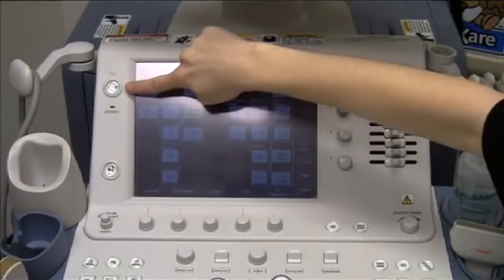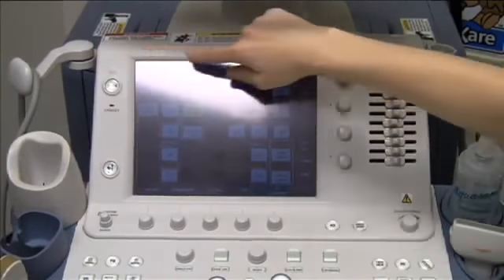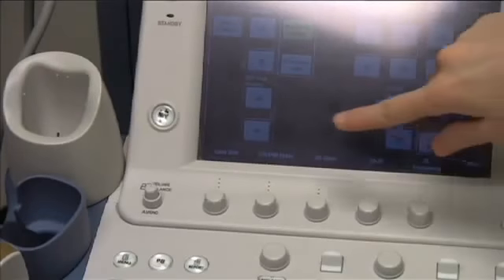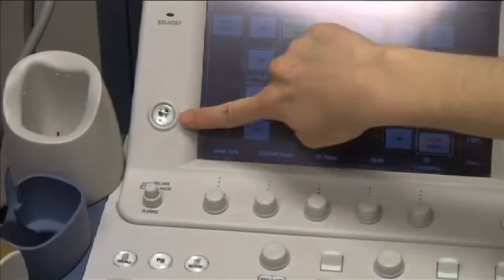To power on the machine, press the power button. It'll take a moment for the machine to boot up. To start an exam and enter patient information, press the patient button.